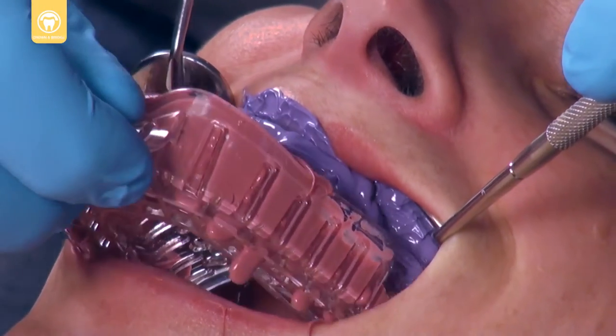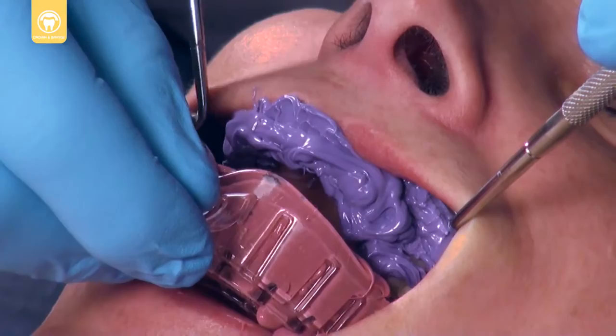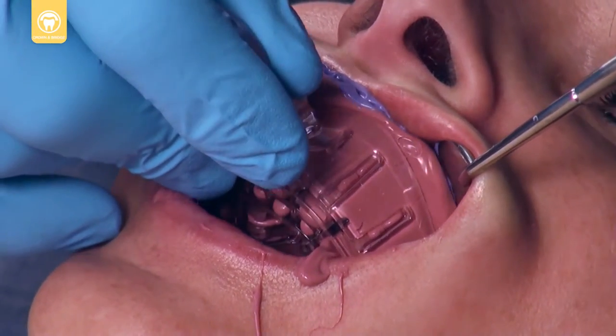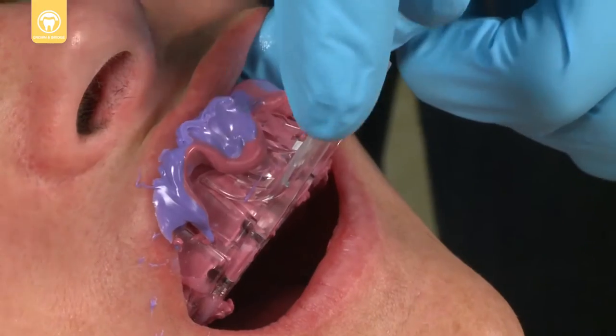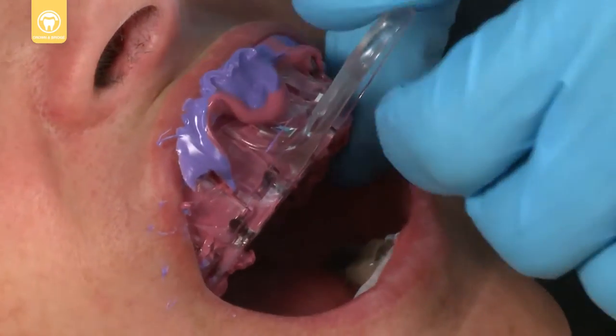Place the impression tray in the mouth. Make sure the tray is centered and gently push the tray onto the teeth. Take care to not force the tray. You do not want the patient to bite down on the impression tray, as that can distort the impression. You want to keep some impression material between the teeth and tray to get the optimal impression.